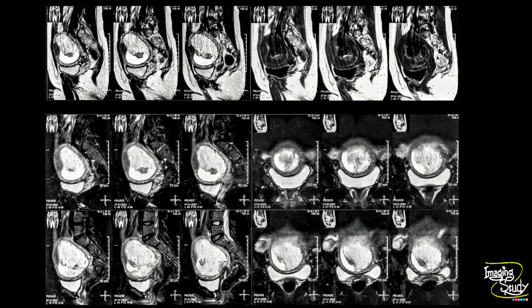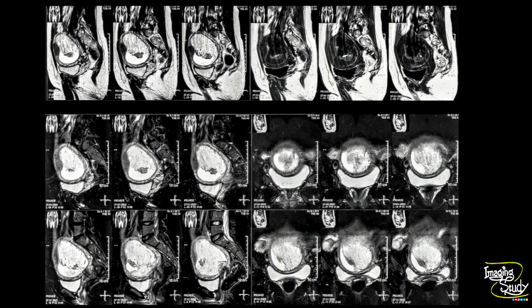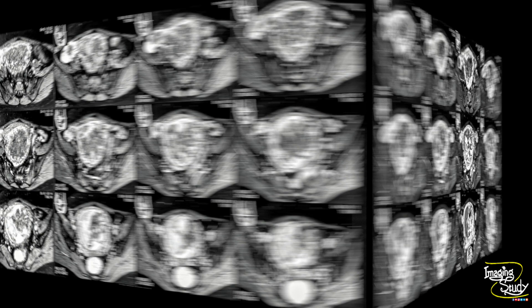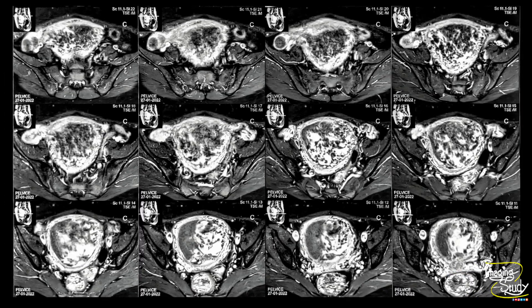As I mentioned, this patient was sent to us for MR imaging — here are a few MR scan pictures. On the contrast image, you can see the left anterolateral wall with aberrant tortuous vessels — these are the tornado vessels. These tornado vessels are also seen along the posterior wall.